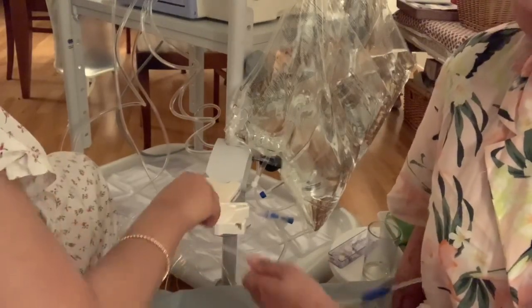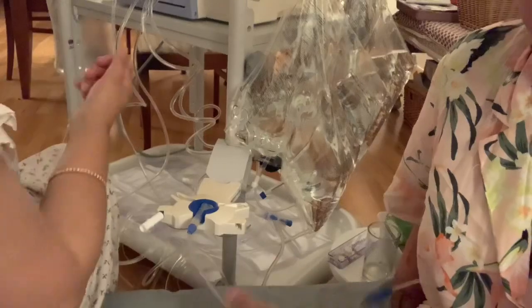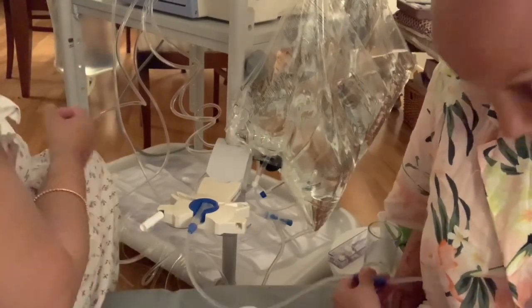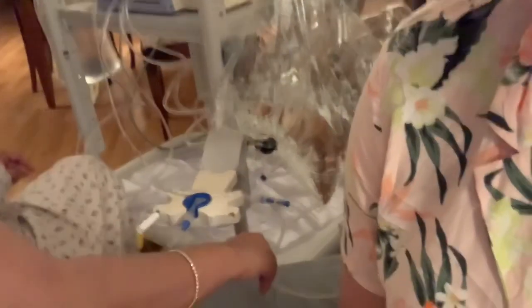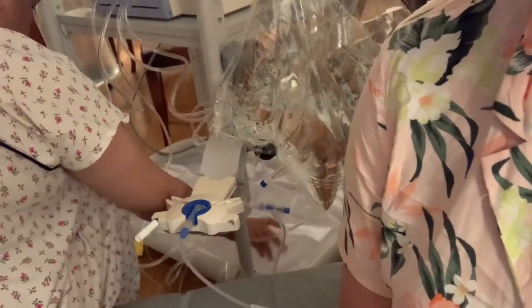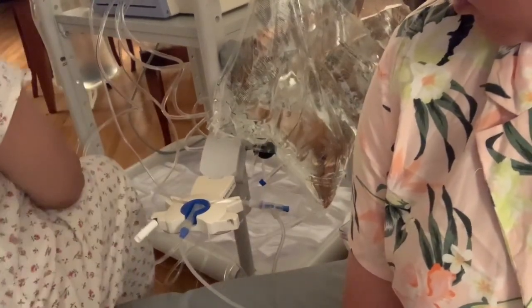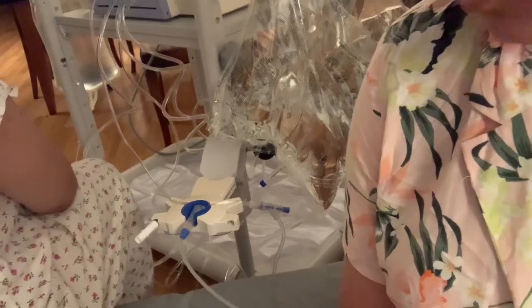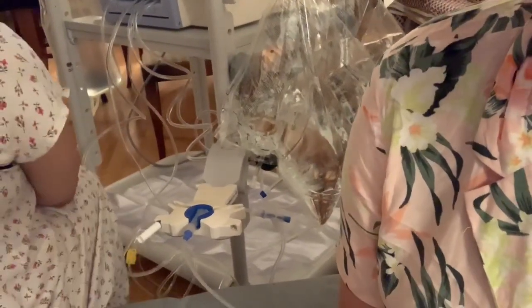I need to open this lock for it to drain out the fluid that's inside me. Let's see how much has come out — one liter went in, so at least one liter should come out again, hopefully more.